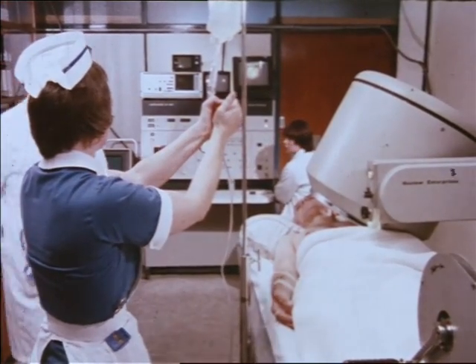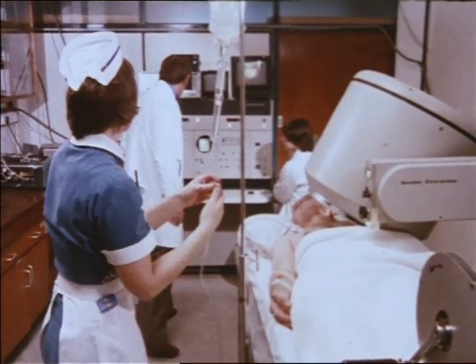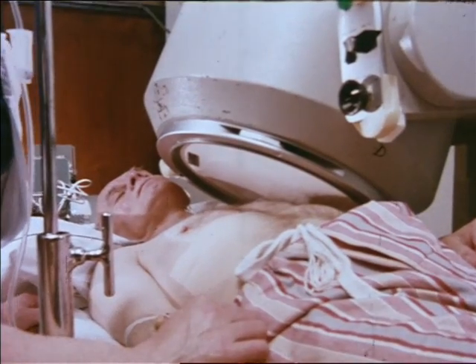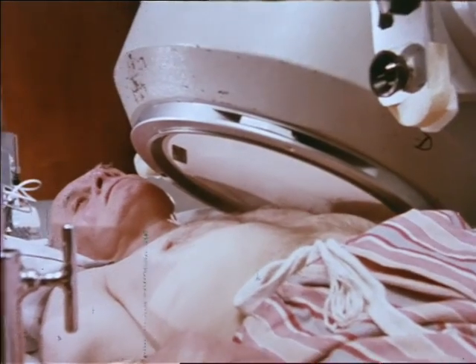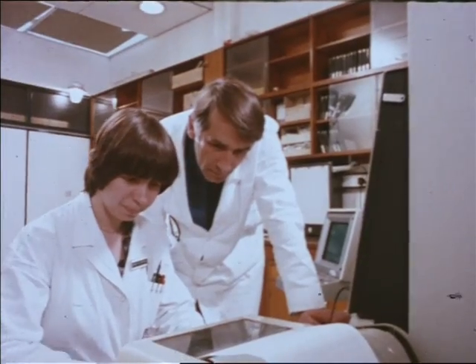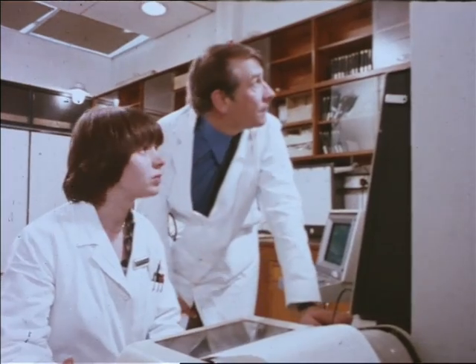As this short-lived radioactive liquid passes through the heart, the radiation is detected by a special camera above the patient's chest. All right, Mr. Sutherland. Won't be long till lunchtime. We have to hope they see. The electrical pulses set off inside the camera are organized by the hospital computer into an image of the heart at work. The rapidly moving yellow patch on the right is the left ventricle, the part of the heart that pumps the blood around the body.